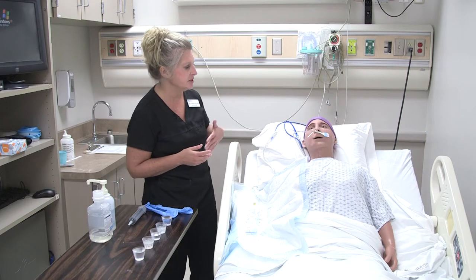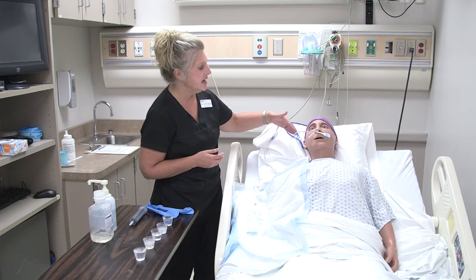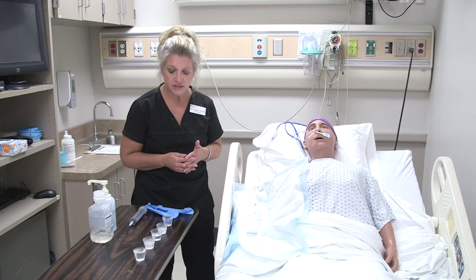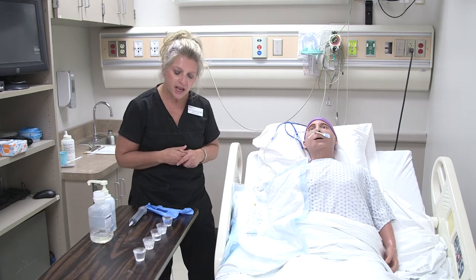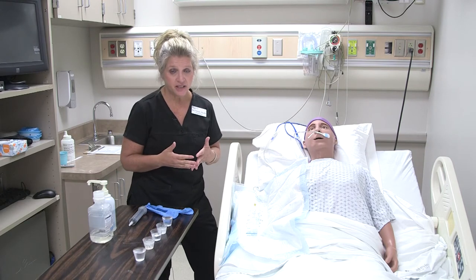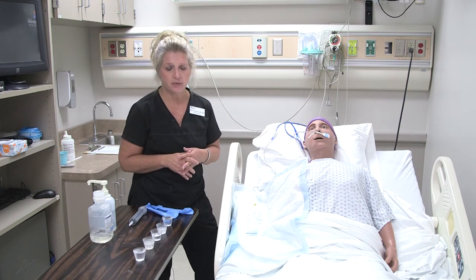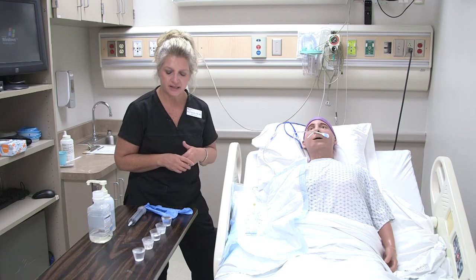We want to assess the patient and assess the nares — looking at skin integrity and the integrity of the mucous membranes inside the nostrils — and also do our GI assessment before giving the medications. Just like with oral medications, if a medication requires an assessment prior to giving it, make sure you do that. For example, if I'm giving this patient captopril, I want to make sure I'm checking the patient's blood pressure and doing a cardiac assessment as well.